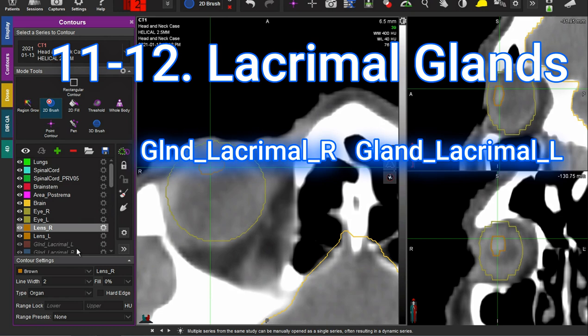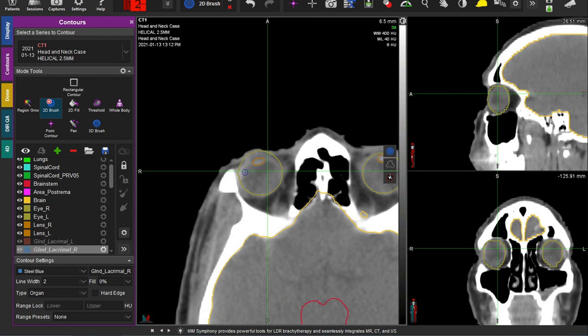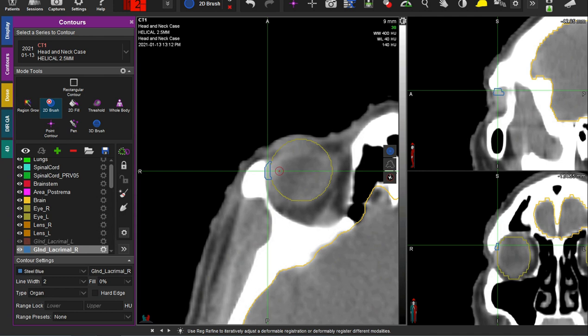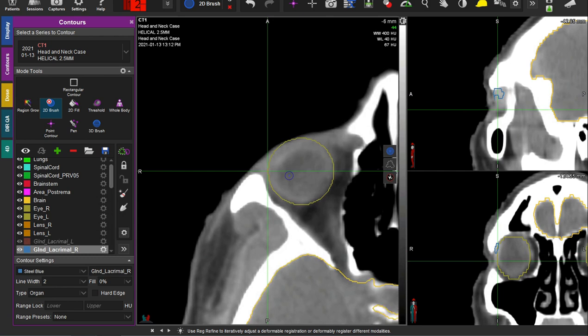Next up we have the lacrimal glands. These are not always contoured by radiation oncologists, but if you're doing a nasopharynx case or something in the scalp or eyelid where you're pretty close, you definitely want to preserve lacrimal glands. They're located laterally — you can see this sort of brighter area here. This is the lacrimal gland; it's hard to delineate exactly, but what matters is including some sort of structure there so you can tell your planner to avoid hot dose in this area.